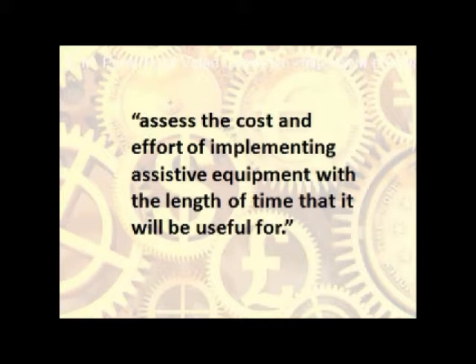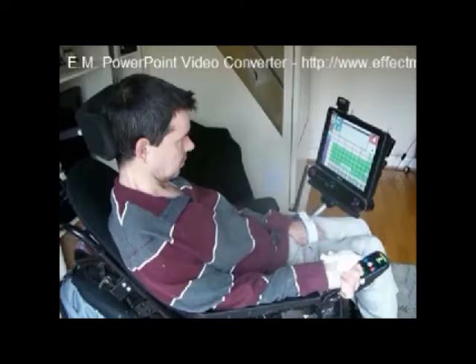Like everything with MND, you have to assess the cost and effort of implementing assistive equipment with the length of time that it will be useful for. It was this assessment process which resulted in me ditching voice recognition as well as any head-pointing devices. I wanted to invest everything in a technology that I could use indefinitely. And for anyone with MND, eyegaze is the only option.